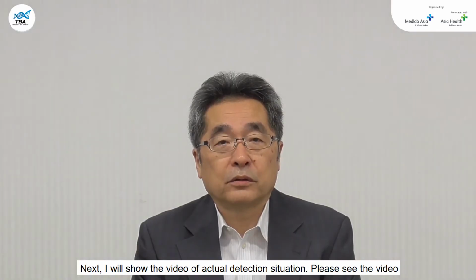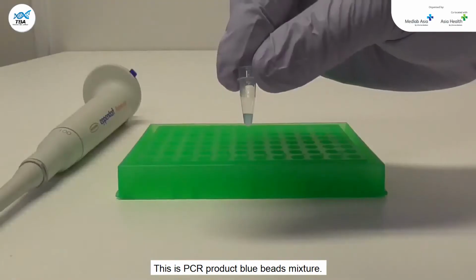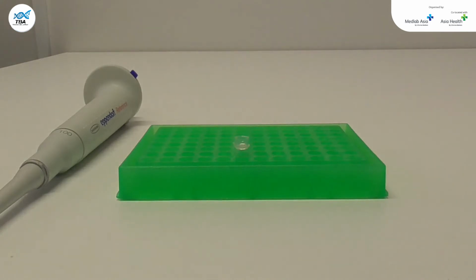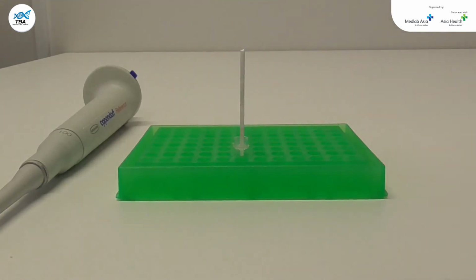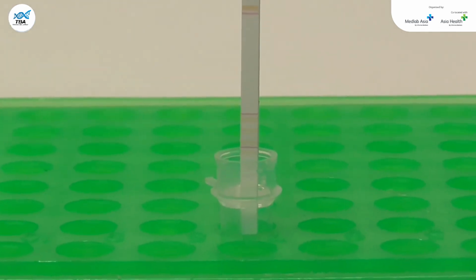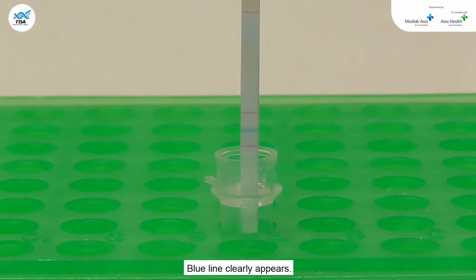Next, I will show the video of actual detection situation. Please see following video. This is PCR product blue bead mixture. Chromato strip put into the tube. Blue line clearly appears.